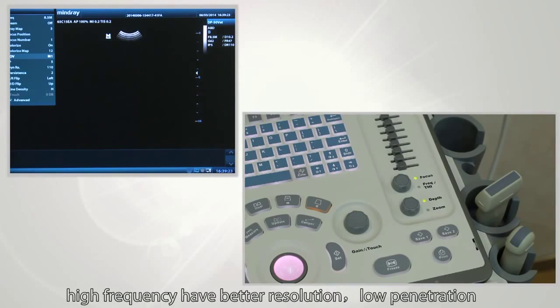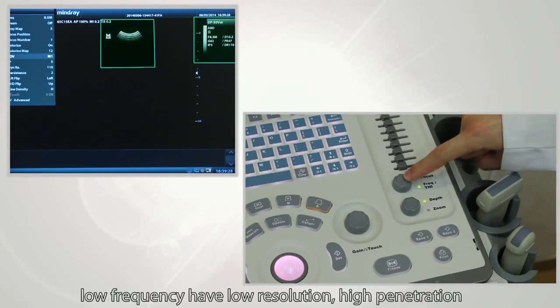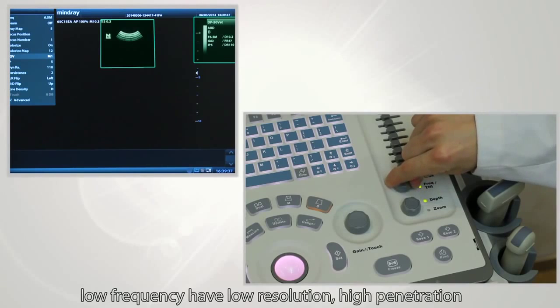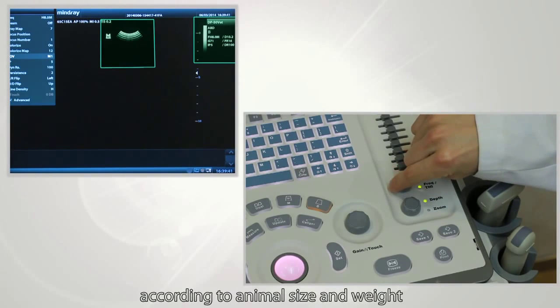Next, frequency. High frequency provides better resolution but low penetration. Low frequency has lower resolution but high penetration. Choose the right frequency according to animal size and weight.